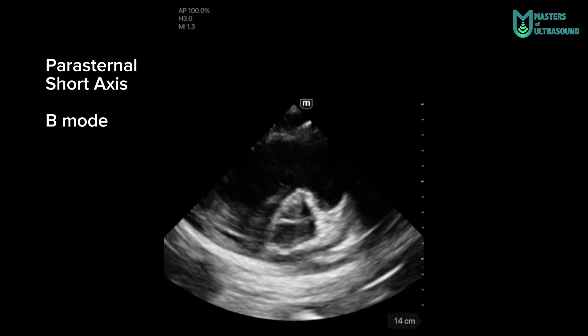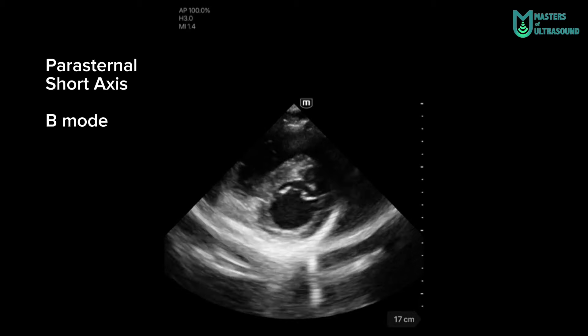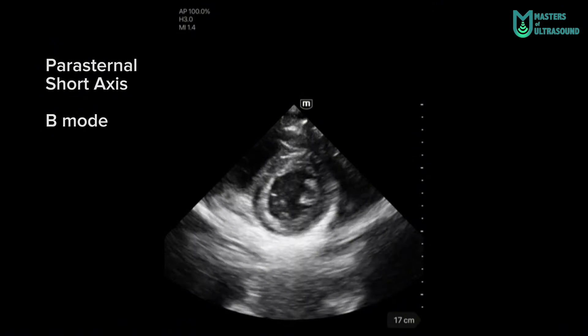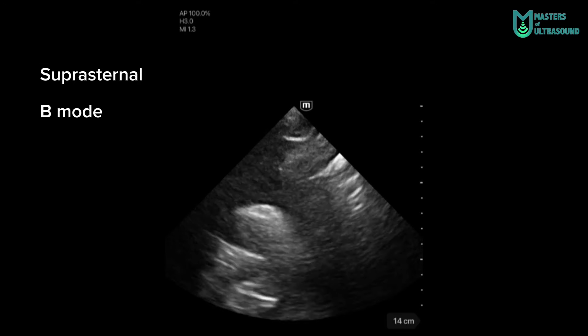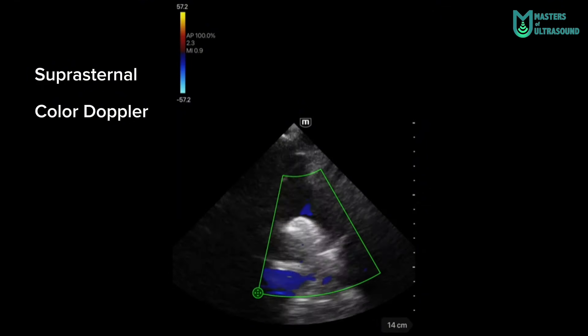Here you can see the tricuspid valve and a little bit of an artifact. This is at the mitral valve leaflets, and here are the papillary muscles — same short axis. Here you can see a suprasternal notch view in B-mode, seeing the aortic arch and the supra-aortic trunks, and here with the color doppler.